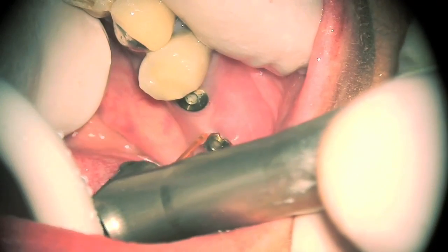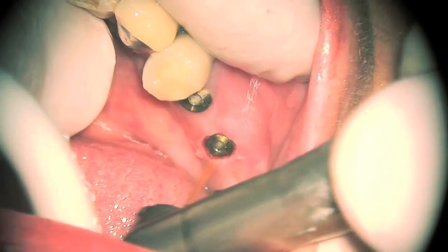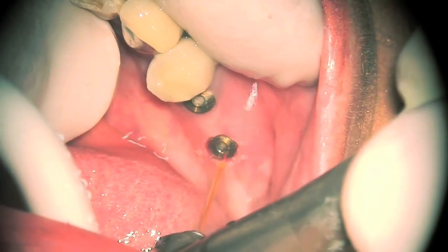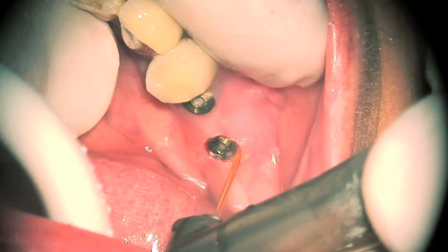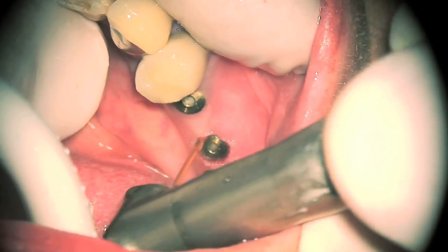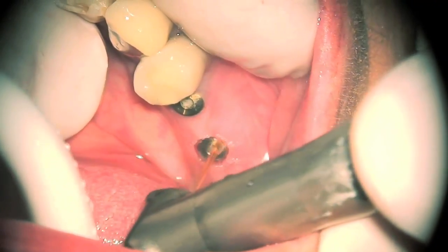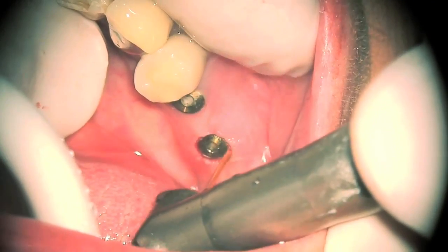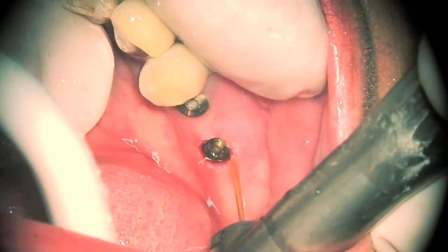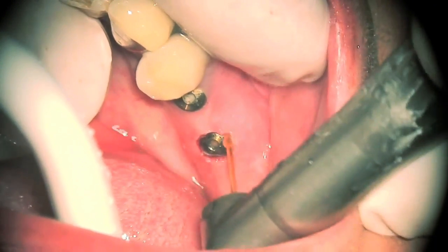As the video is showing, I am getting the emergence profile right now. Notice the lack of bleeding — very little bleeding. At this point the implant is totally uncovered, and now I am doing a little more emergence profile work.